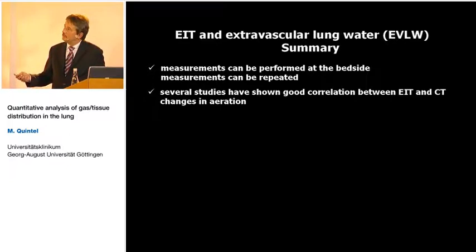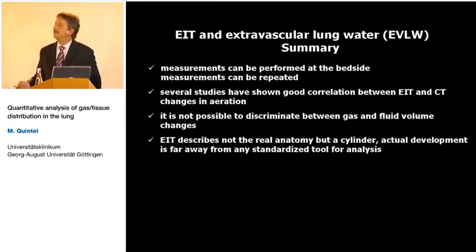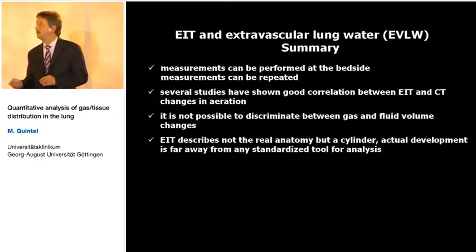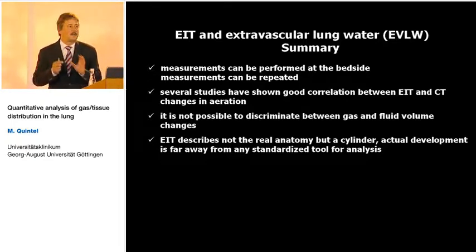Several studies have shown good correlation between EIT and CT changes in aeration. That's quite true. It is not possible to discriminate between gas and fluid volume changes using the EIT technique. EIT describes not the real anatomy but a cylinder, and actual development of EIT techniques and interpretation is far away from any standardized protocol or tool for analysis.